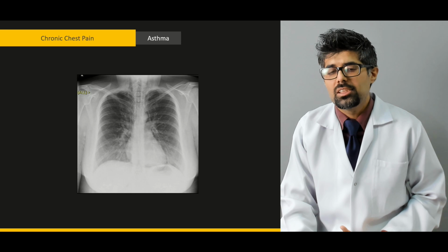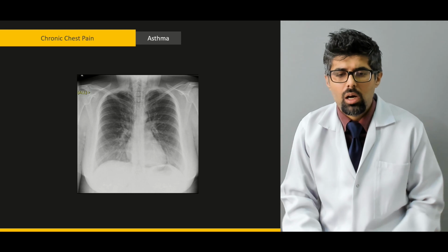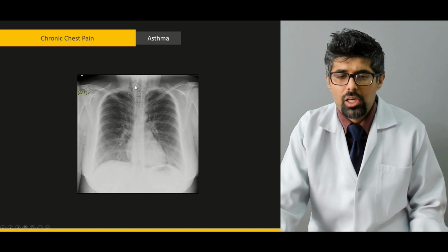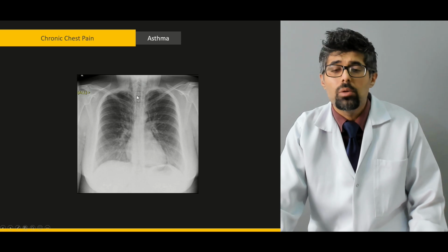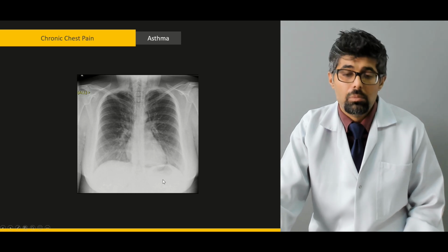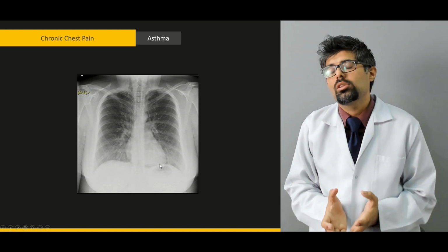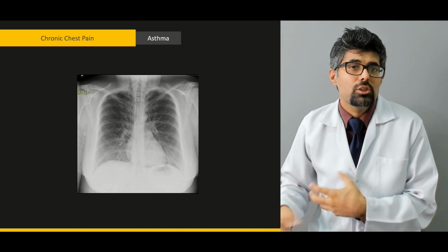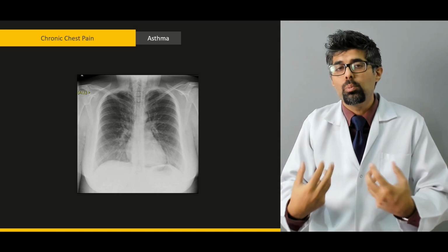Asthma usually presents with a simple plain chest X-ray. There aren't usually any signs. The margins are okay, the fields are okay, the bones are okay, the vertebral column, the trachea, esophagus, heart, diaphragm, the air in the stomach, everything is normal. Yet for an asthmatic patient, the diagnosis is mostly a physical one. An asthmatic patient is usually diagnosed on his physical exam. That is his inability to breathe.